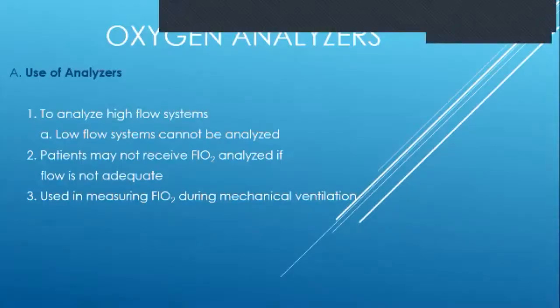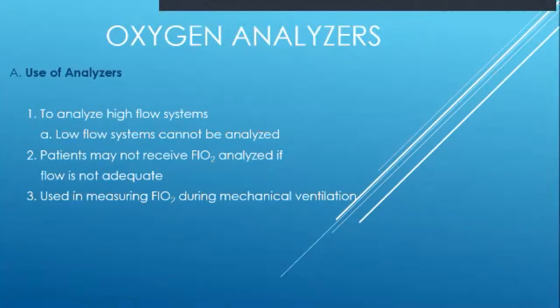It's used in measuring the FiO2 during mechanical ventilation as well. Mechanical ventilation is life support, the ventilator. And the ventilator does it itself. You don't have to analyze the oxygen content on a ventilator. That is automatic, it's in the machine. But if something was to happen and it's not working for whatever reason, you can analyze it.